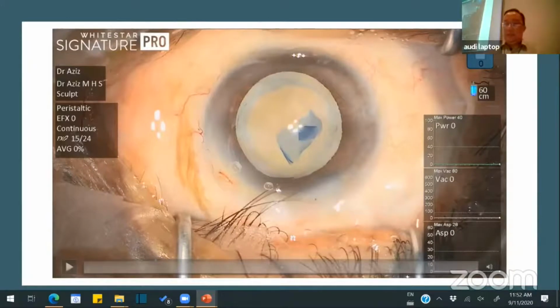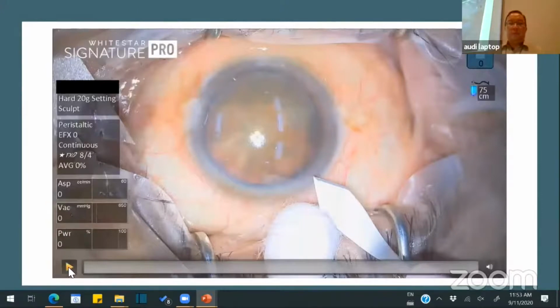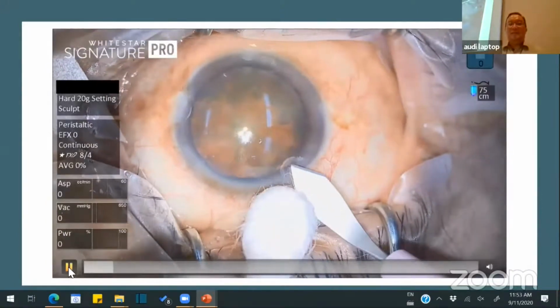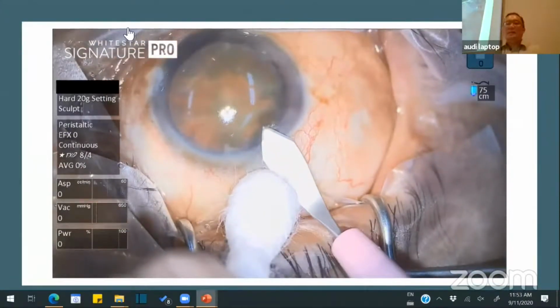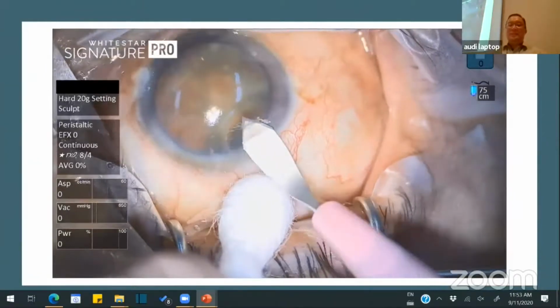So I think it's my last video. Sorry, no, it's not my last. Okay, let's see what we have. Okay, it's done in my training. I erased the name. Okay, the same wound. Okay, see the striation. All right, so see properly.